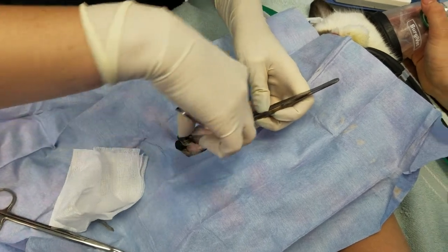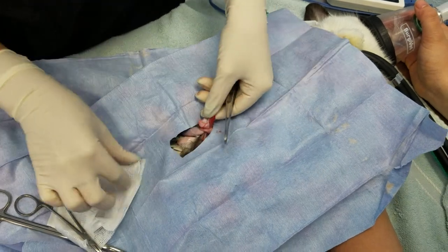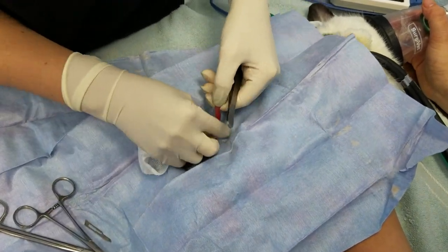And basically now we've got to, well, we can do that, replace our inverted scrotum. That tends to happen.